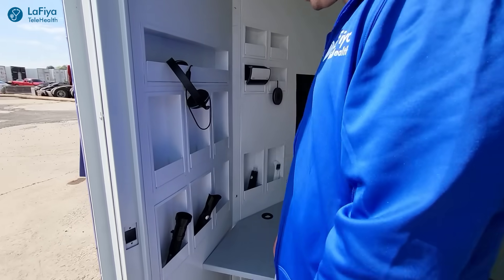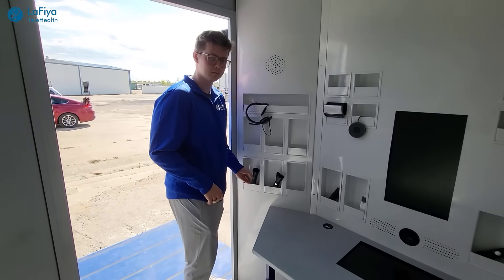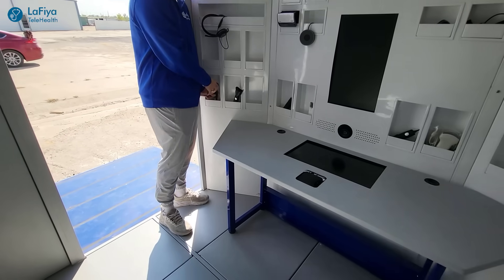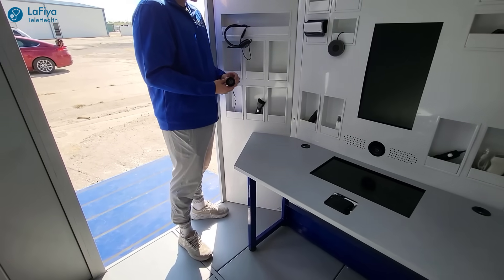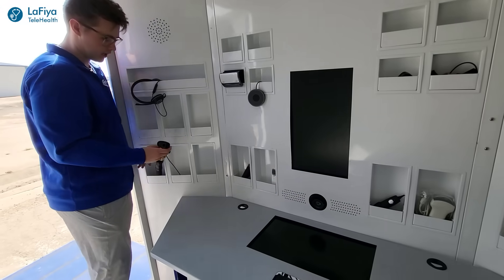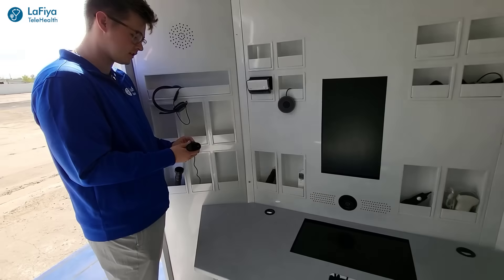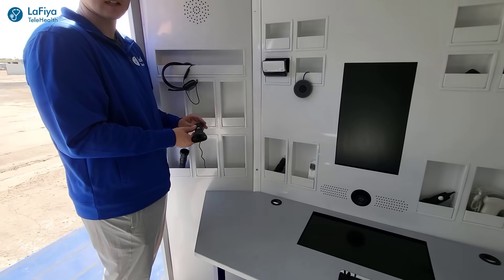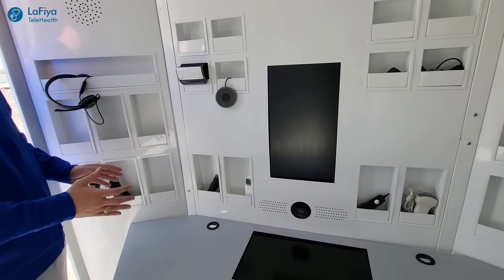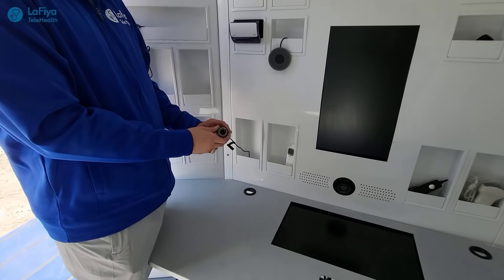Inside this kiosk there are a number of different medical devices to assist patients and connect with the doctor to help them better understand what is going on with the patient. First is this full body exam camera. Secondly, we have an eye camera — patients are able to use this remotely and the doctor can see what is going on with the patient from wherever they are. All of these tools are integrated with the LaFiya Health System, allowing the doctor to see what the patient is showing.